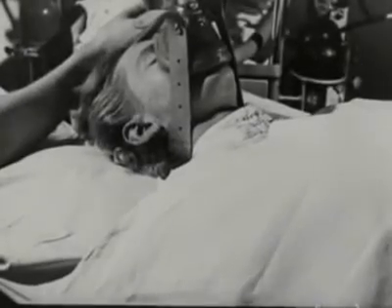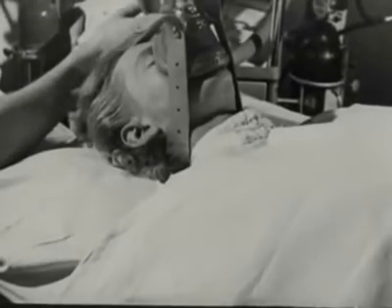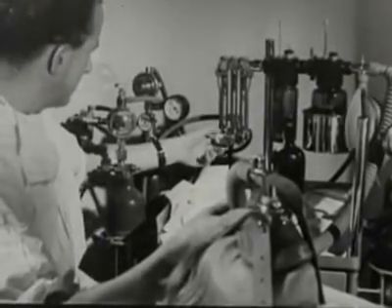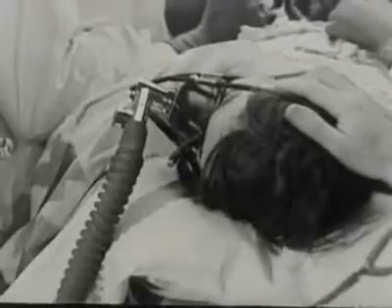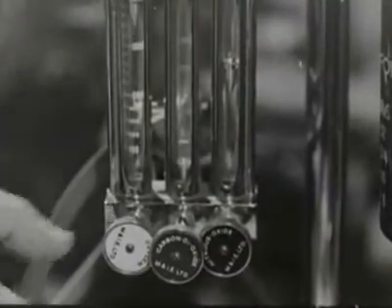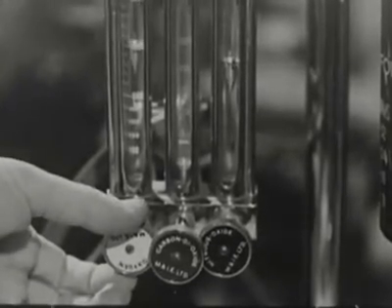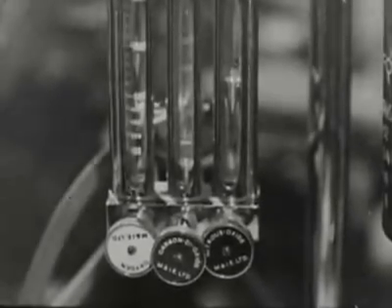If the patient becomes at all cyanosed, for example because of shallow breathing due to excessive premedication, you must be prepared to raise the proportion of oxygen. A patient who is suffering from shock or anemia must be given at least 20% of oxygen, even if cyanosis is not apparent. To do this, you can raise the flow of oxygen, or you can lower the flow of nitrous oxide, thereby producing more rebreathing, carbon dioxide accumulation, and so deeper respiratory excursion.